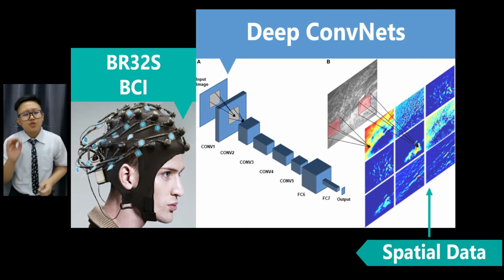This study also focuses on spatial data or visual data instead of time-dependent data. Spatial data is like a map of the signal you are studying with all the positions and measurement information. This is why it is the perfect choice when solving complicated three-dimensional problems such as our brain's physical structure.